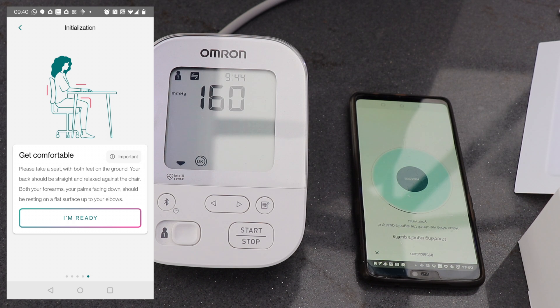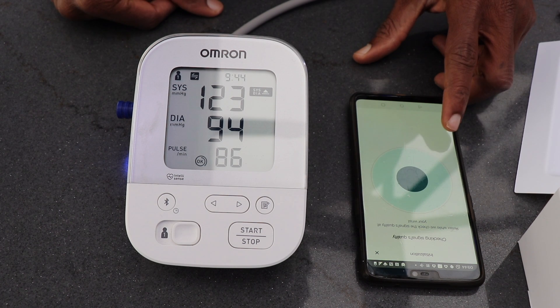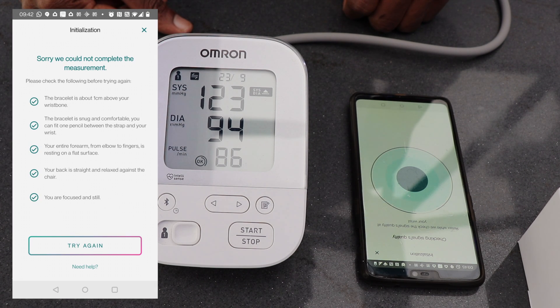Here I'm taking my blood pressure reading on my blood pressure monitor — I just want to see how the readings compare. It did take me about four or five attempts to be able to get a reading from the Atcare cuff.